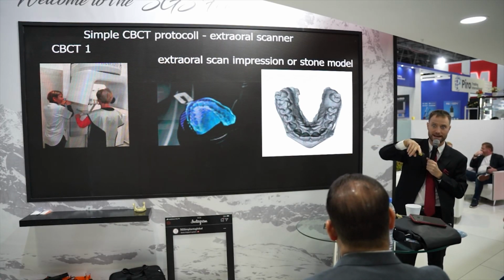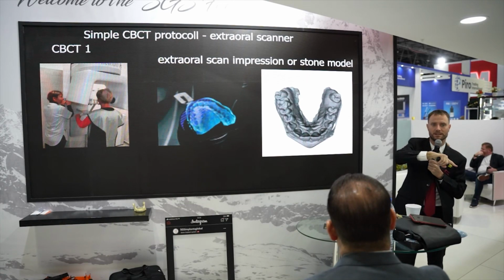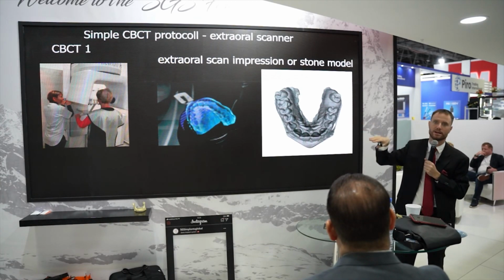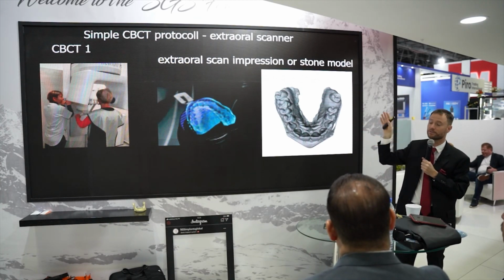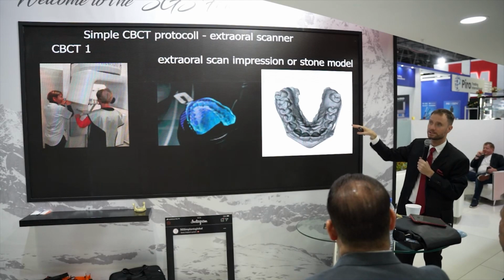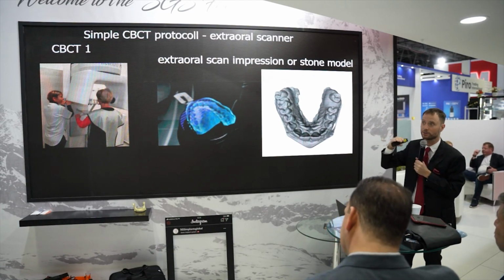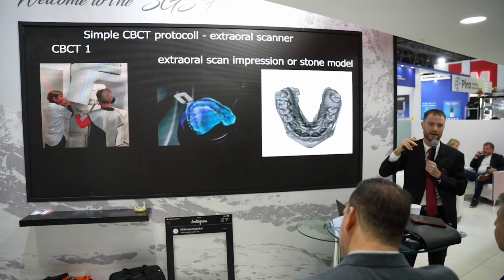That's where I reflect back to what I told you with the CBCT and the medical CT. The medical CT doesn't care about your metal artifacts. Your CBCT is dead where you have an amalgam filling. So that's a factor when you do it. If you want to do this technique, you either remove the amalgam fillings of the patient, or you consider that you have a limitation, you need a certain number of healthy teeth.